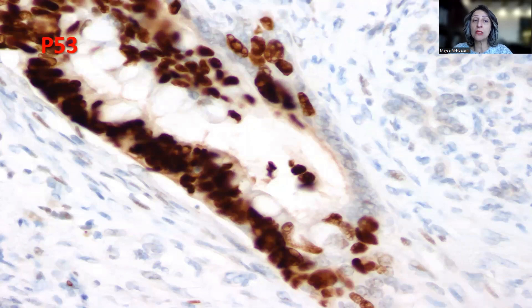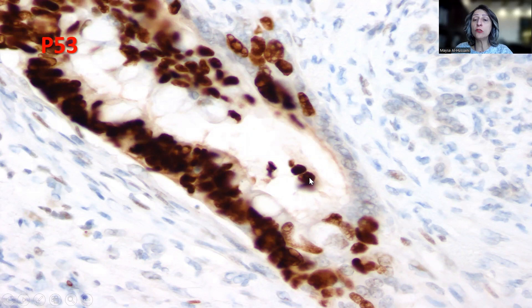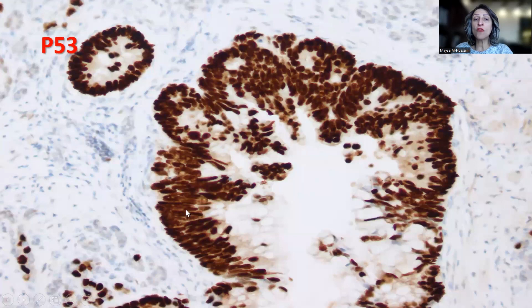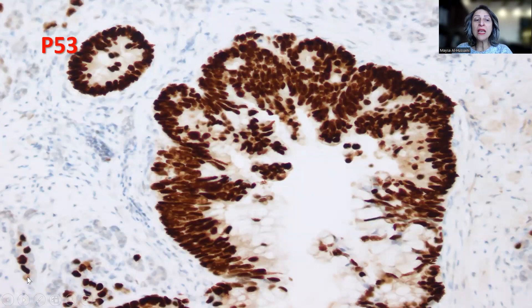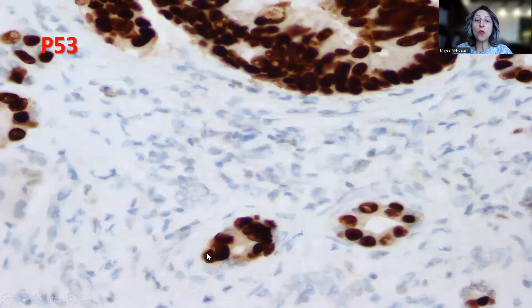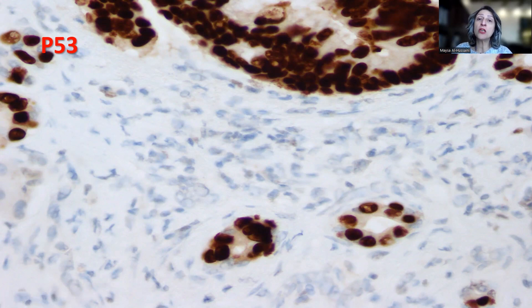The P53 immunostain was really notable, showing strong diffuse positivity consistent with abnormal P53 expression in one of the branching ducts, in contrast to the normally appearing epithelium. The villiform transformation stains strongly positive with P53 in most of the tumor cells. The small glands forming the colloid carcinoma component also stain positive with P53, meaning they are a clonal proliferation originating from the main dysplastic duct.